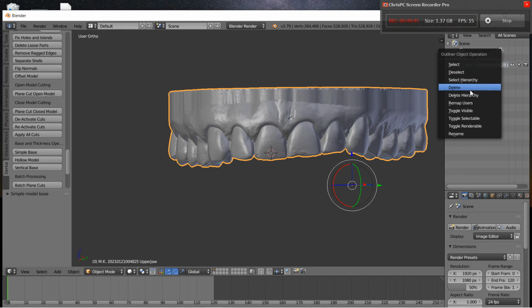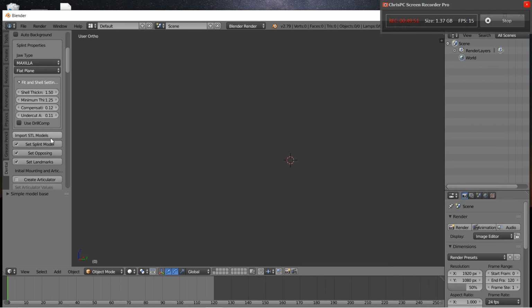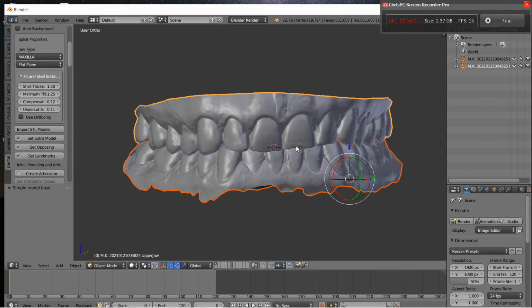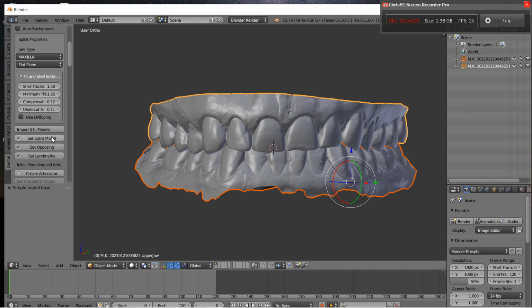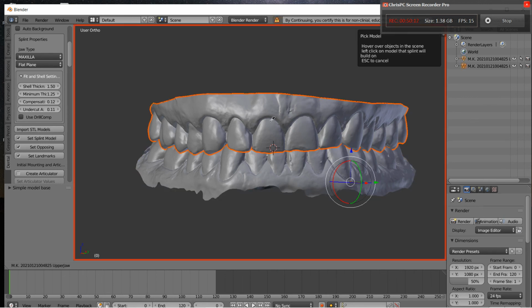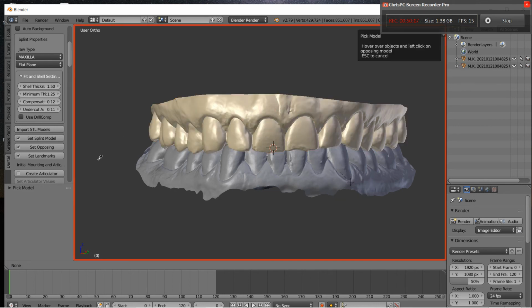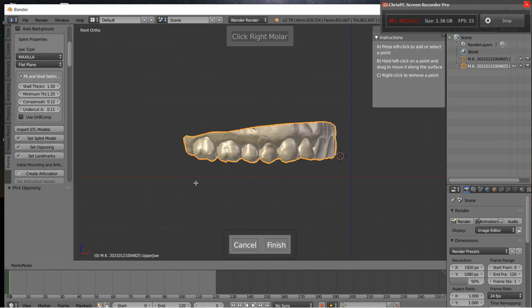Now, if I want to go ahead and create something like a night guard, it's just as simple, and I'm going to walk you through that entire process. So as we talked about earlier, if we import our upper and lower models as STLs, STLs not only are a wire mesh framework of the teeth, but you can also see it records how my bite actually came together. Now, these softwares make it extremely simple to delegate. It walks you through step by step. We can select which jaw is the active jaw. Then we can left click and select which jaw is the opposing jaw.